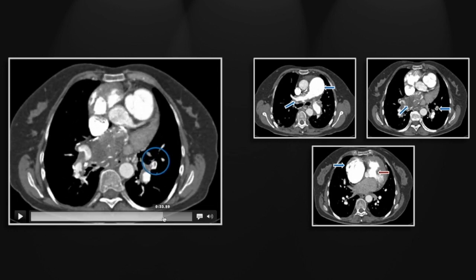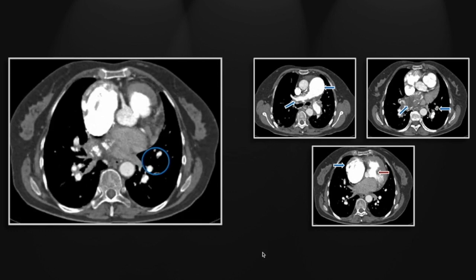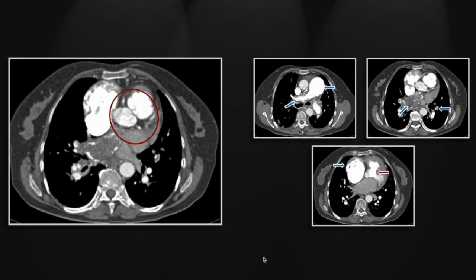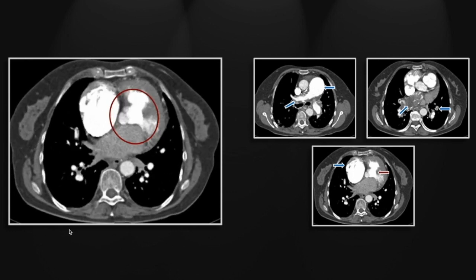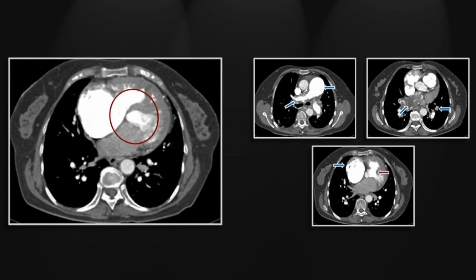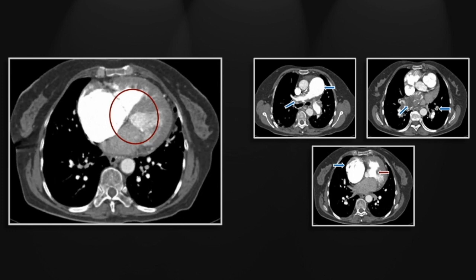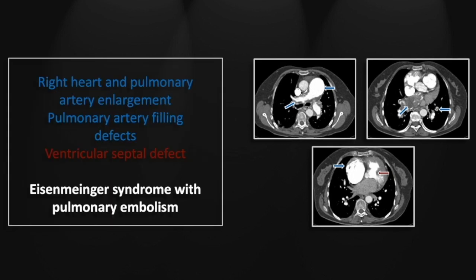Looking at the left lower lobe, that central filling defect has the appearance of an acute pulmonary embolism. The ventricular septal defect shows dense contrast passing from right to left, representing relatively acute right-to-left shunting most likely resulting from the acute pulmonary embolism and an abrupt increase in pulmonary hypertension exceeding arterial pressure, allowing shunting in the opposite direction to occur.